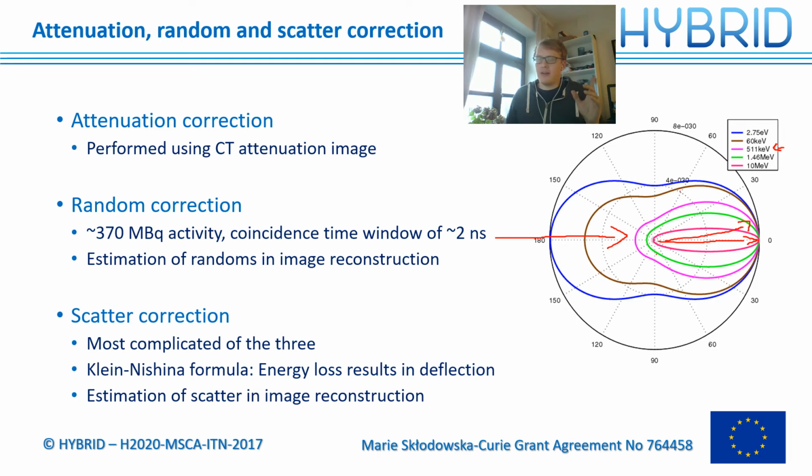Let me take that away right now. We are already using simulation software to correct for this. And in one of the videos, we will also focus on whether we can reduce the amount of scattered coincidences based on the energy loss. However, in the end, if there is energy loss, can we measure it?